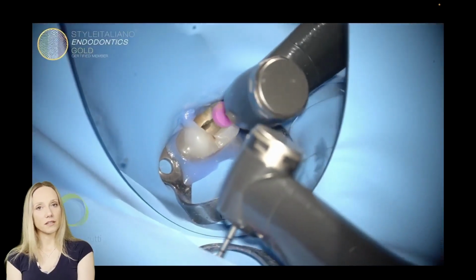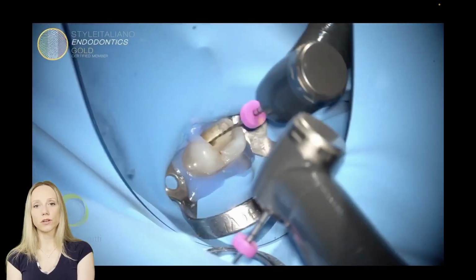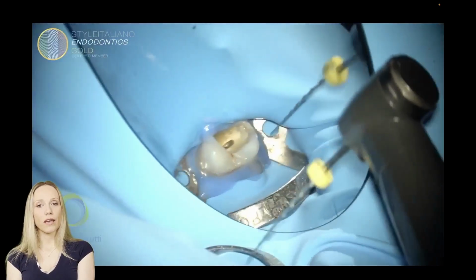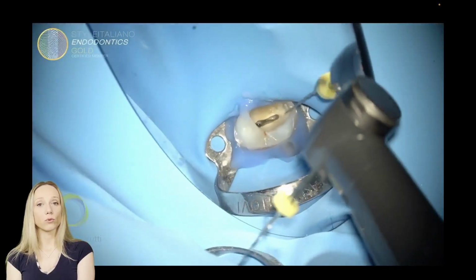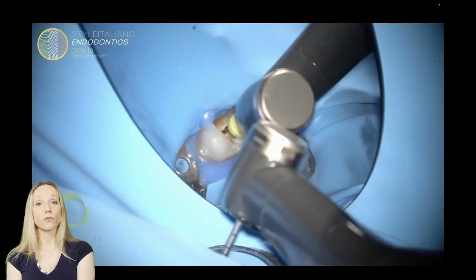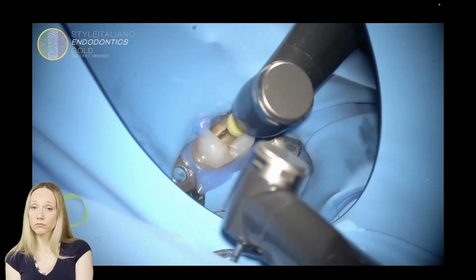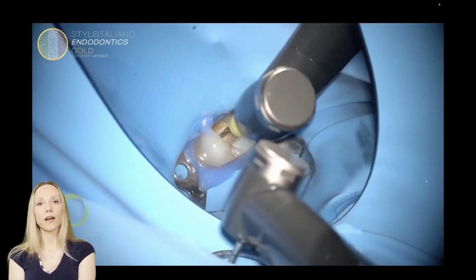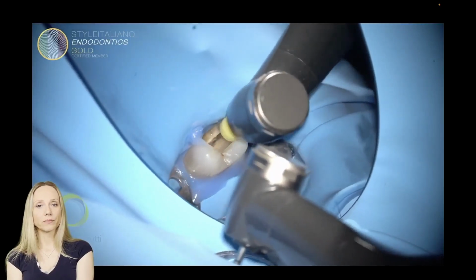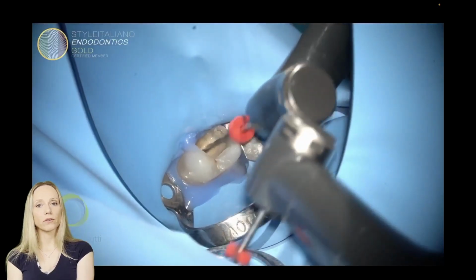And then once I did this on one root canal, I do the same on the other root canal. I go with my 1303 first. When I have reached the working length, I go with my 2004. I'm using the files at 400 rounds per minute, according to the manufacturer's instructions. I do not want to invent anything. I want the file to work at its best. Picking motion, and then I change the file, and I go with my 2506.